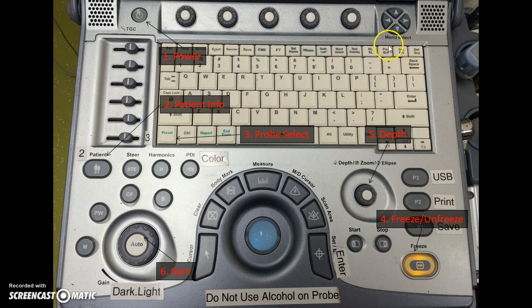Secondly, and this becomes even more important when we get into documentation, is patient info. So documenting a new patient on whom we're performing an ultrasound. By clicking this button here, it allows you to enter information about the patient, the ultrasound modality you'll be using, who is doing this, when it was done, so that you can pull it up for later use. And we can also use that later in quality assurance.